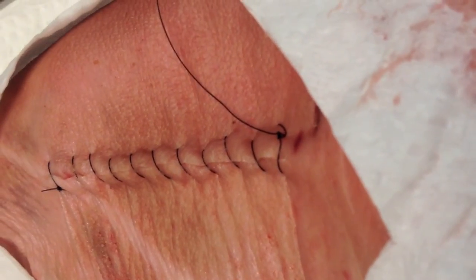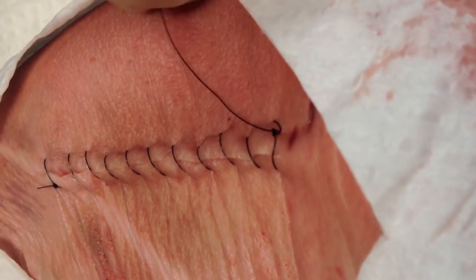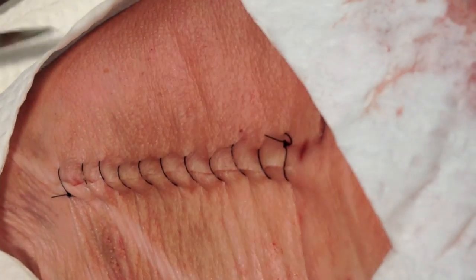And that's going to give you your continuous percutaneous suture closure. Cut the end and there you go.